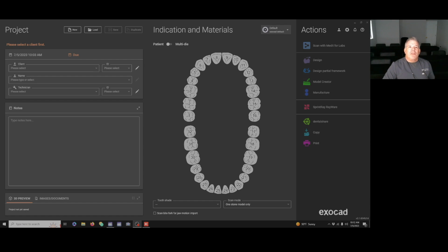There's no better time to start doing digital dentistry than right now. Digital dentistry not only increases treatment efficiency and accuracy, but also ensures predictable results. With digital dentistry, we can achieve more at a reduced cost while delivering superior outcomes for our patients and clients.